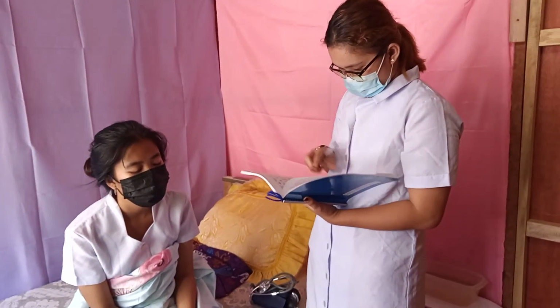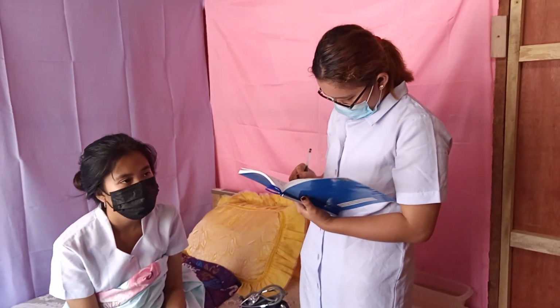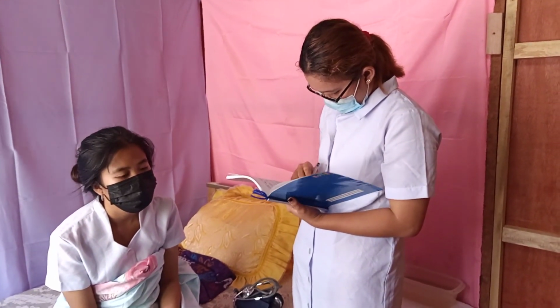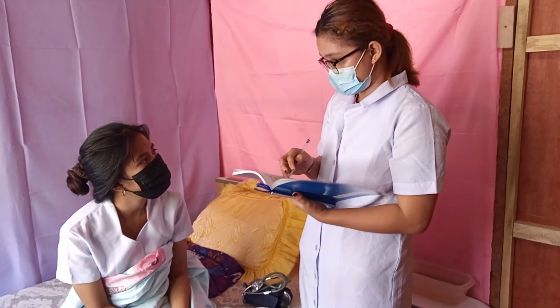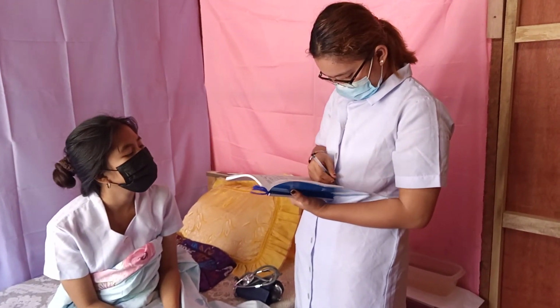Then, the last procedure is documentation, or record the result taken. Rationale: for monitoring purposes. So, ma'am, ang BP niyo po ngayon is 110/. And that's all for the blood pressure taking.